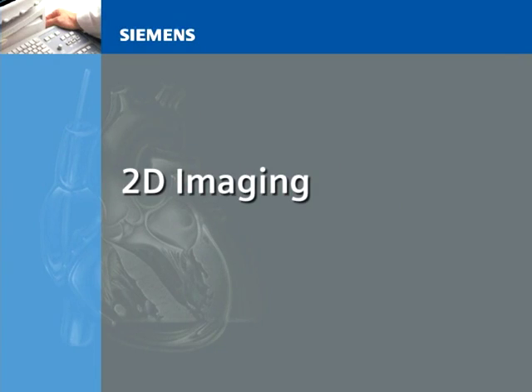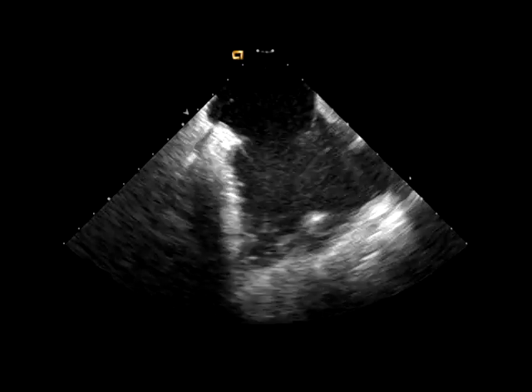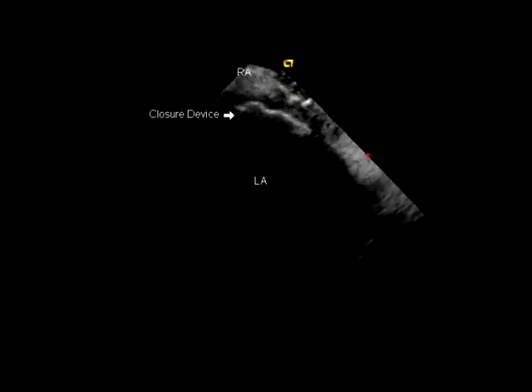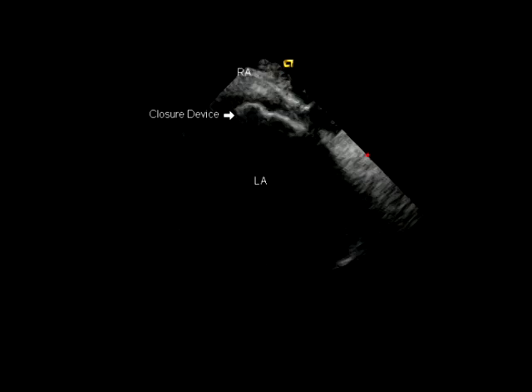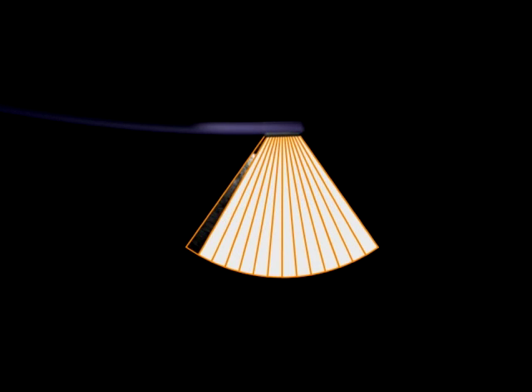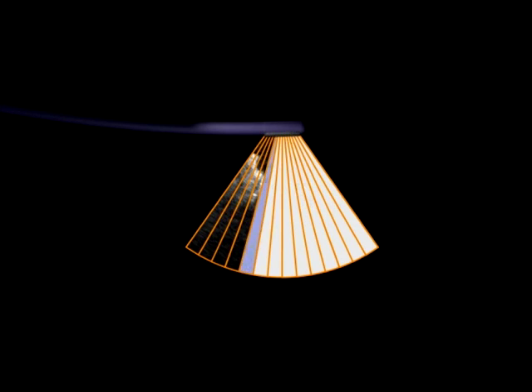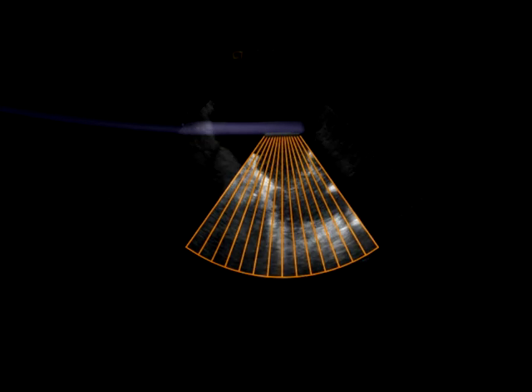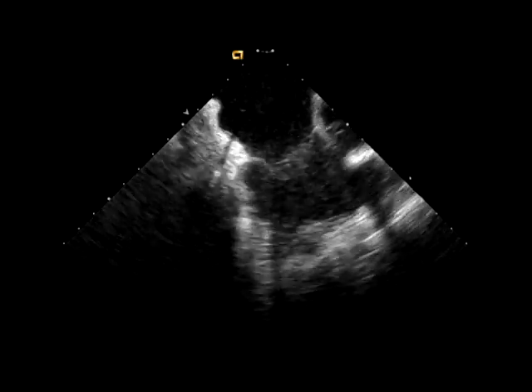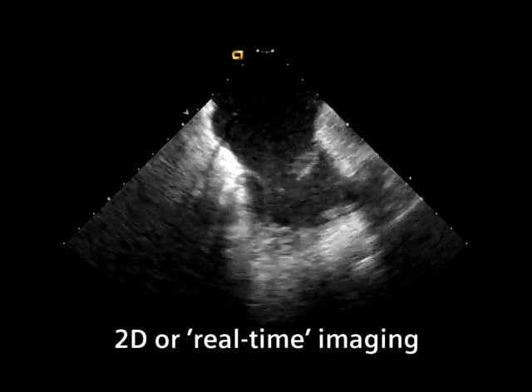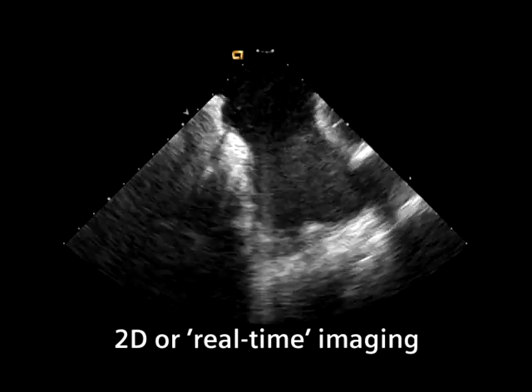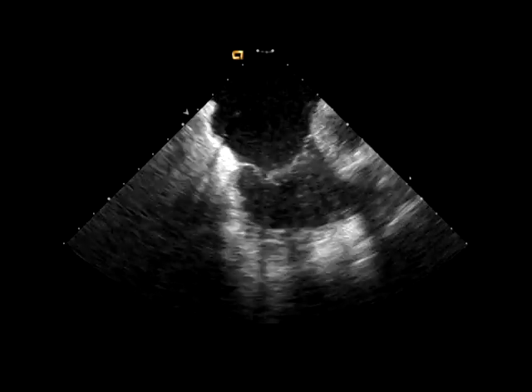2D Imaging. Two-dimensional ultrasound imaging allows the visualization of cardiac structures and devices within the heart in grayscale. By using multiple crystals and electronic steering of the ultrasound beam, multiple lines of information can be collected and collated to display ultrasound information in two dimensions with motion. 2D imaging is commonly referred to as real-time imaging because cardiac structures and motion are seen.